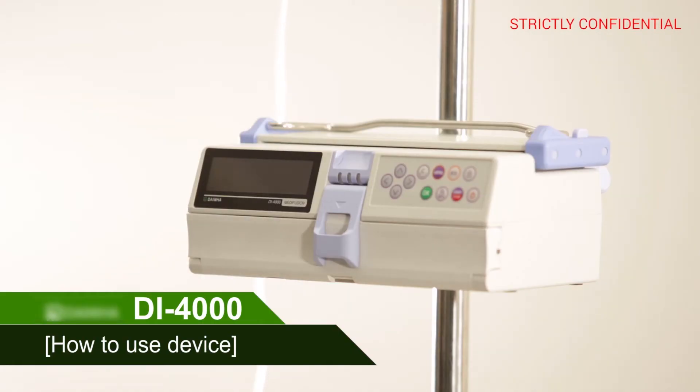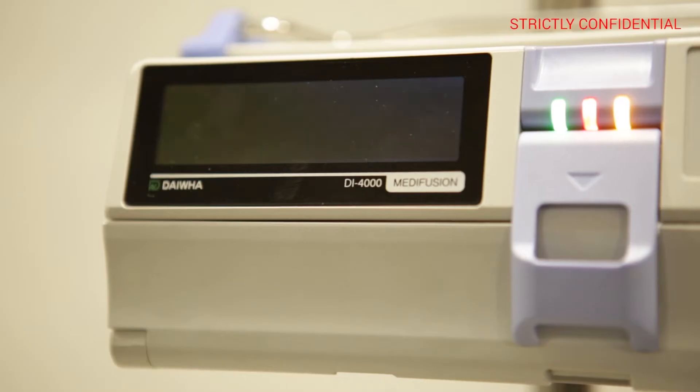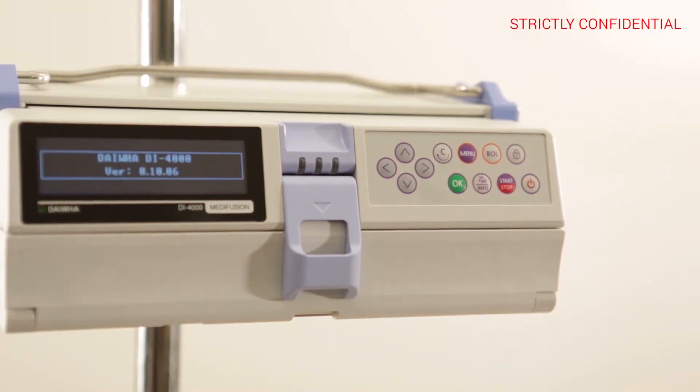How to use the device: connect the power. If the indicator on the right of the LED alarm lamp turns orange, power is on. Then press the power button on the membrane switch.